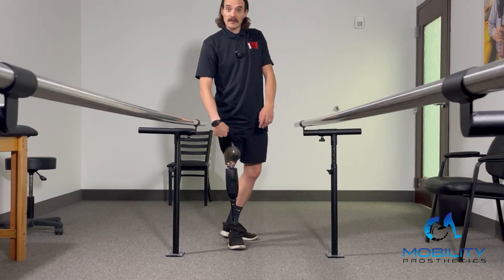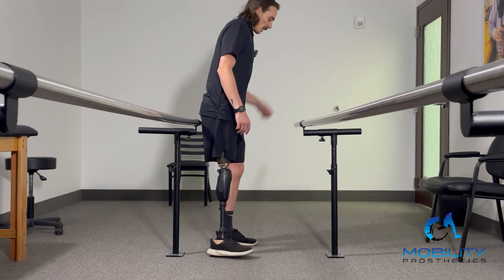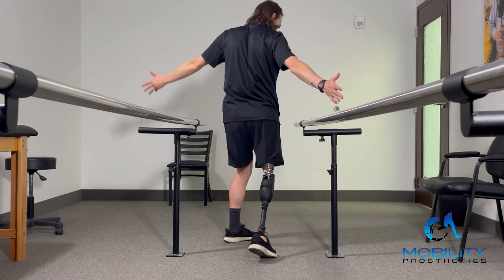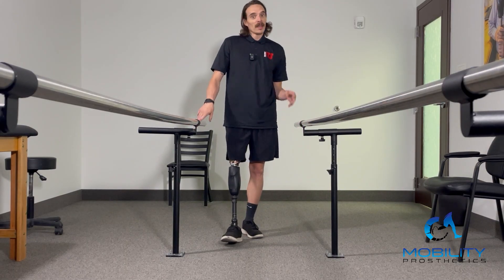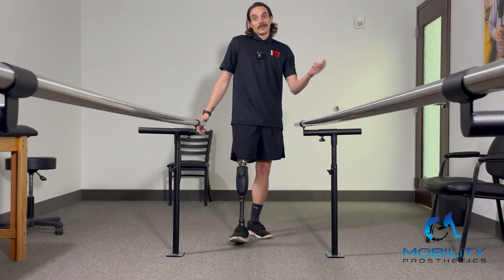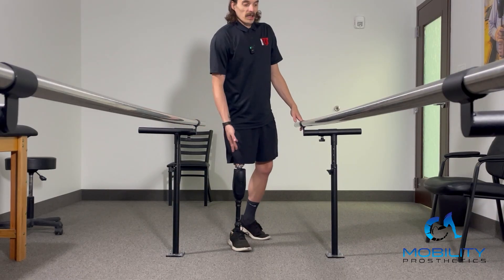To start with golf mode, click into the Freedom Innovations app, go down to golf, then the adjustment tab, and click on 15 degrees. Golf mode is designed to lock out at 15 degrees — you can see the knee is locked and won't let me go past that. If I want to release, I shift my weight and sink back in. As a righty I can get a good pivot and still feel safe all the way through. One thing to be aware of is that if you're walking down a hill, the knee is locked out in golf mode, so you need to be careful on ramps or downhill terrain.